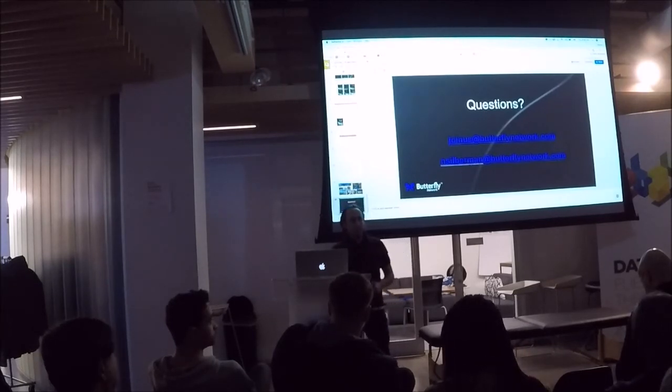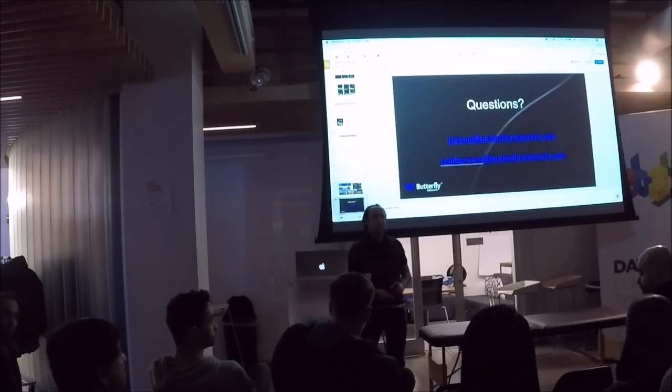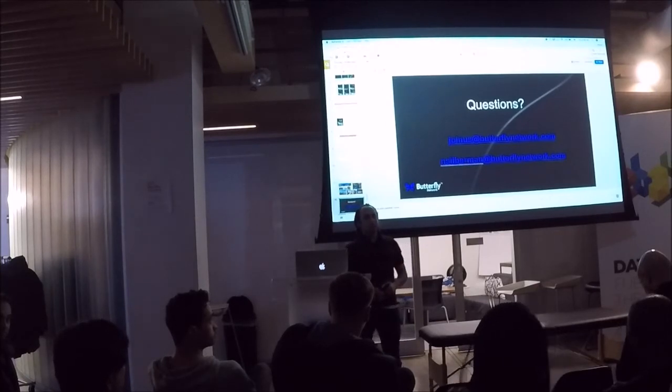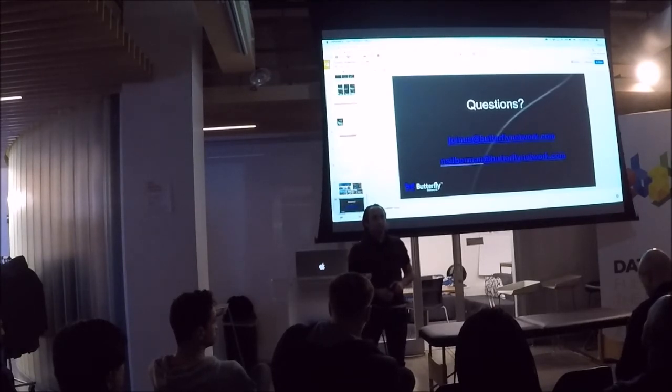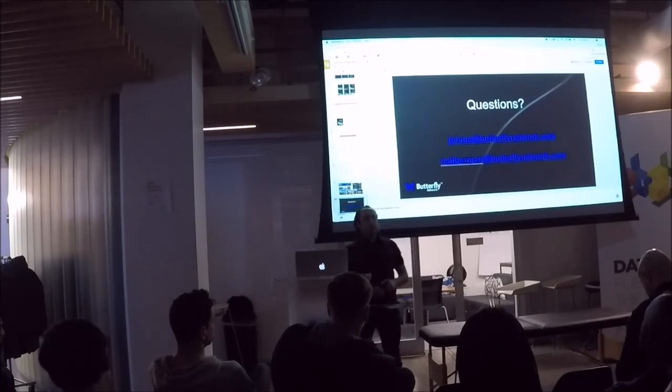One question, you're using measures of the image in order to gain some sort of idea of the position of the sensor. And I wondered if you considered in your product process, you must have, simply embedding some sort of 3D sensor to track the location of the sensor on the body, and therefore use that to get users into the right position.